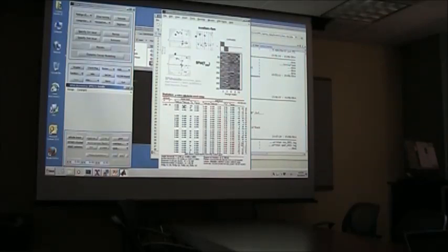False discovery rate means that you will pick up more regions, but you will also pick up more noise regions that you will call significant. And then you can see differences between cluster level and peak level statistics. It's possible that something would be significant at a cluster level but not at a peak level. Actually, it's quite likely that this often happens. The other thing can also happen, but it's less likely.